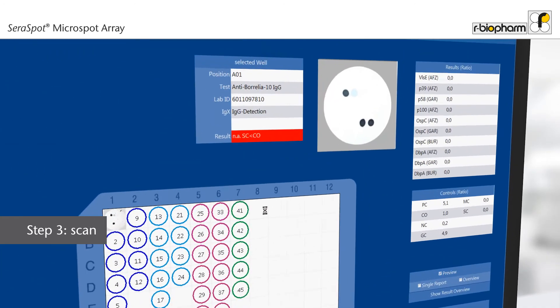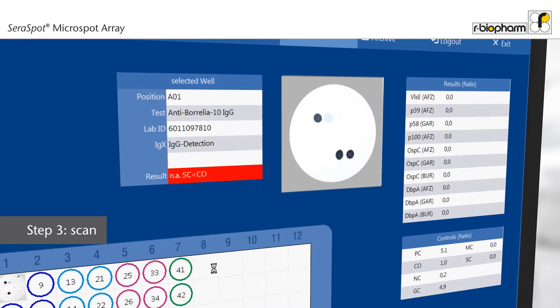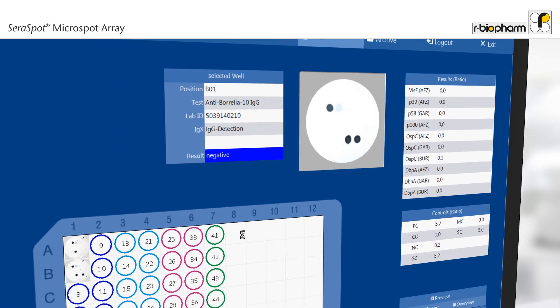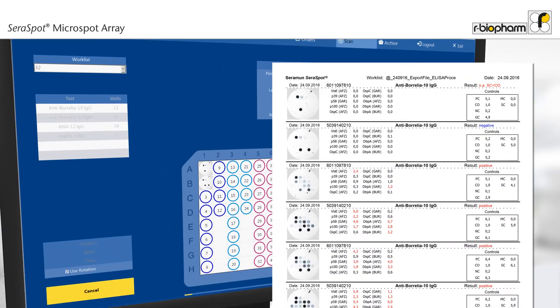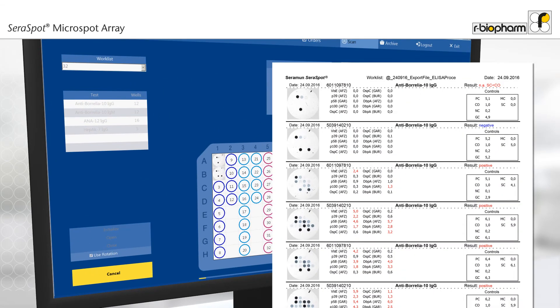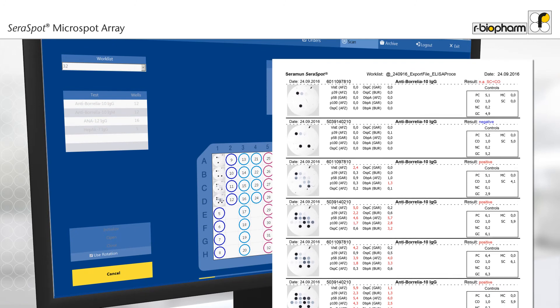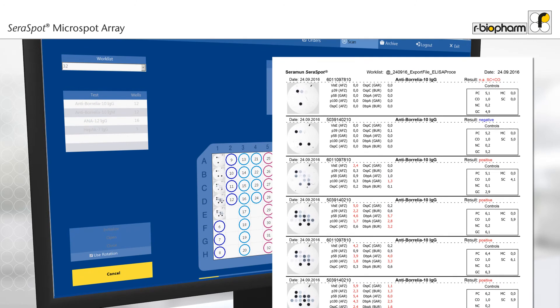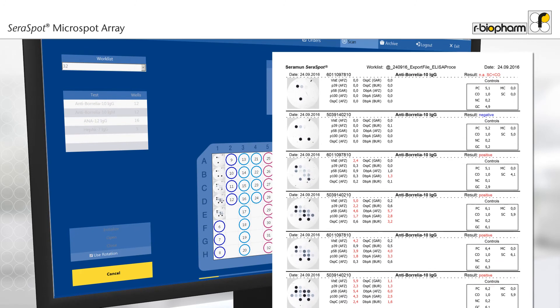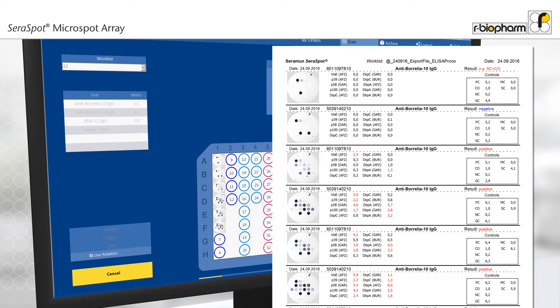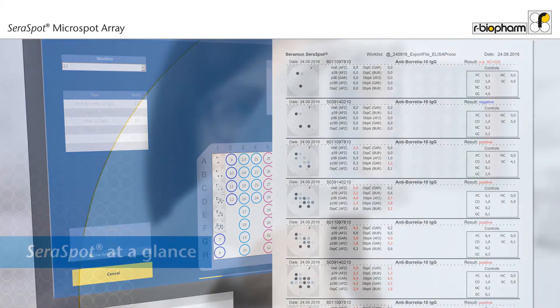Each array is precisely scanned. For all arrays, the software provides detailed information on the test results. The results are documented in a well-organized list showing all relevant information at a glance. Optionally, transfer the results to your laboratory information system.